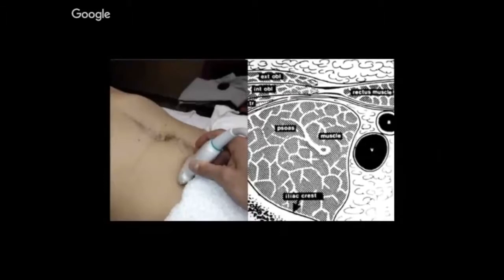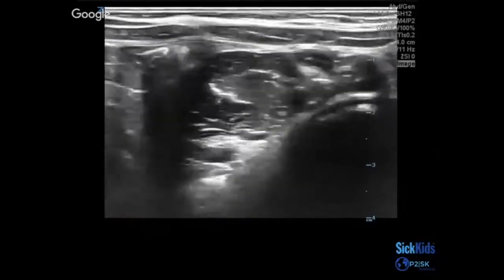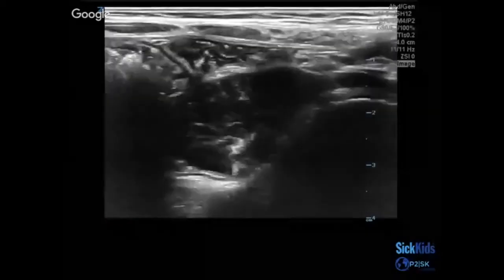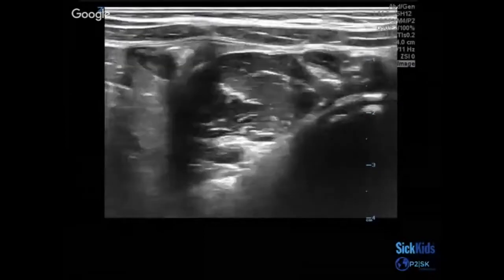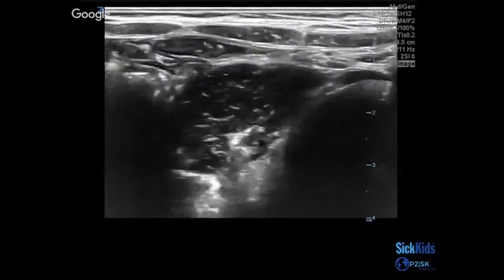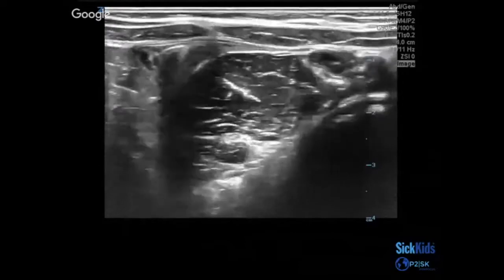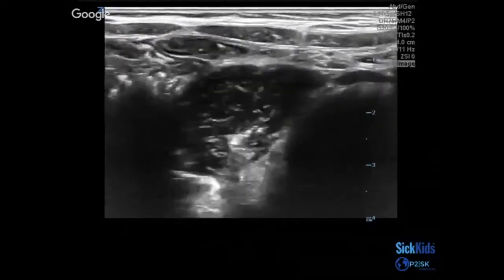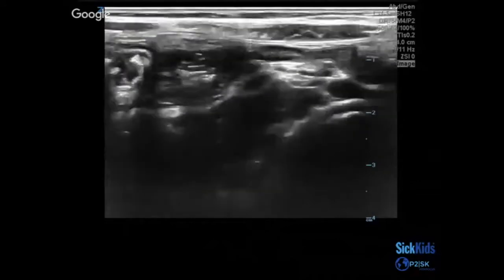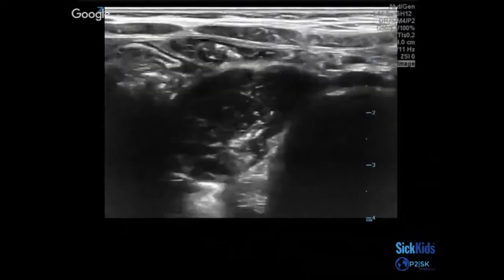Here is an example of a normal scan. The technique requires ensuring the patient has had adequate analgesia and is lying supine. Use the high-frequency linear probe over the area of maximal tenderness — in older kids who can verbalize it, or starting with landmarks in the right lower quadrant for younger kids. Look in both transverse and longitudinal planes throughout the entire abdomen. We typically apply a graded compression technique — gentle pressure in the area of interest — to decrease the distance between the probe and the pathology, and to eliminate overlying bowel gas which can cause artifacts.